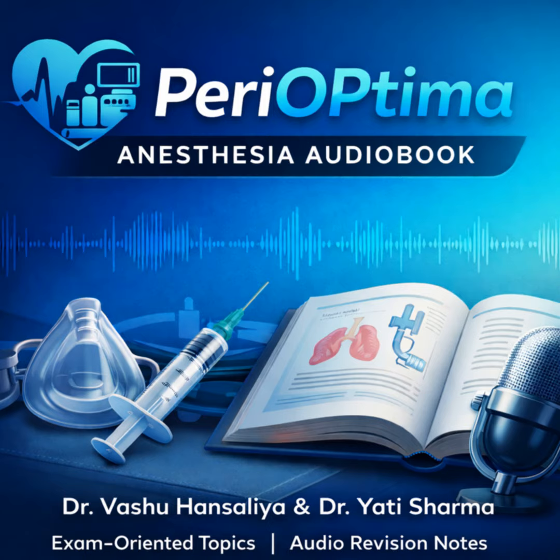But if I need to see the spine in a larger patient or a kidney for a fast scan, you need to go deep. So you need low frequency, long wavelengths. They travel deep into the body, but the picture is fuzzier, lower resolution. That's your curvilinear probe, the one with the big curved head, usually 2 to 5 megahertz. Linear for lines and shallow stuff, curvilinear for cavities and deep stuff.